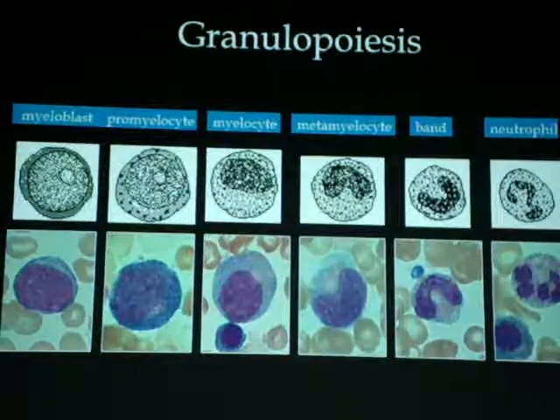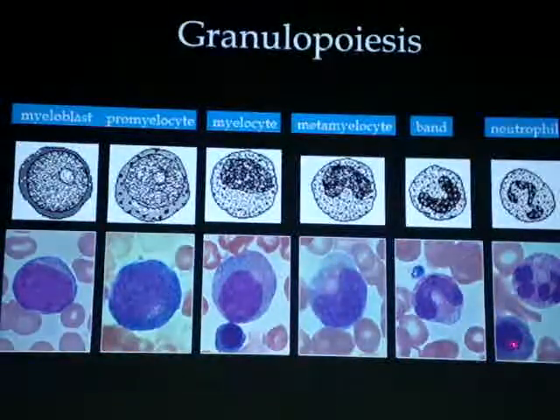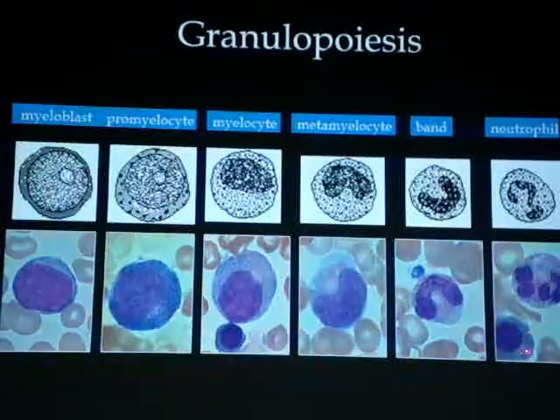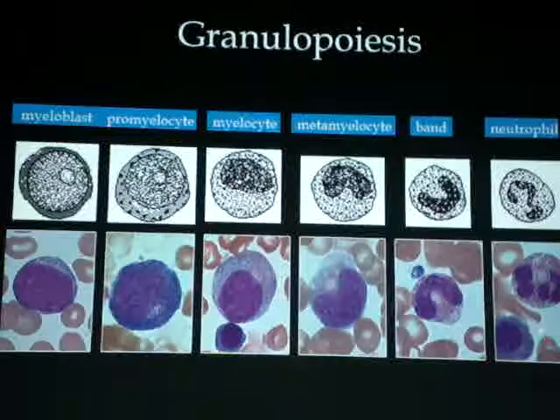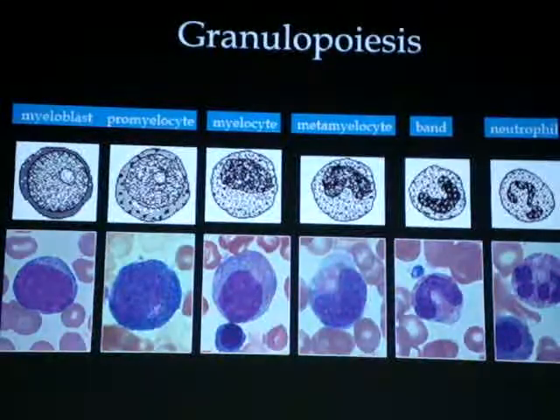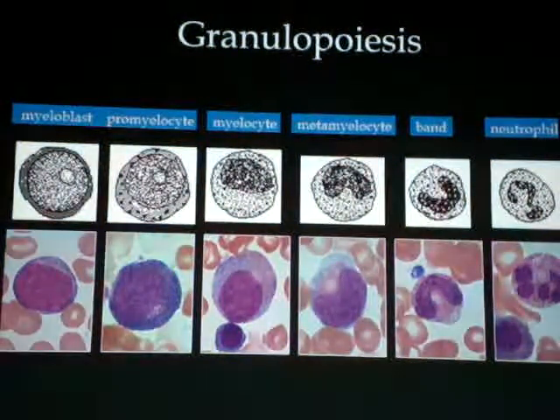Okay, there is an erythroid cell present. Identify that cell. The color of the cytoplasm. What color do you see in the cytoplasm? Violet and pink. So it should be called a polychromatophilic normoblast.